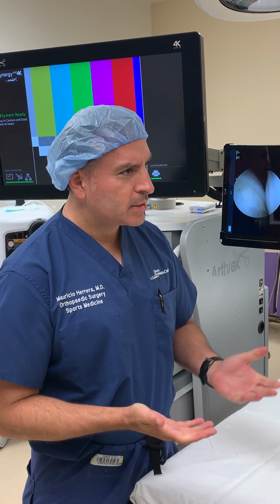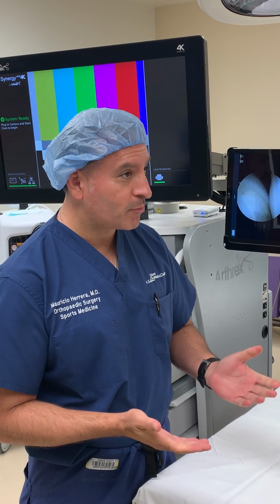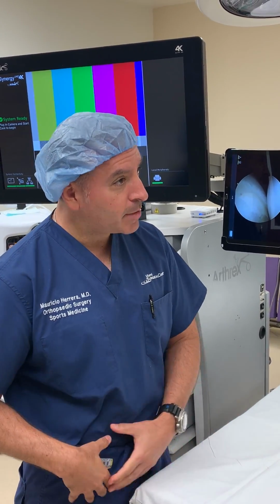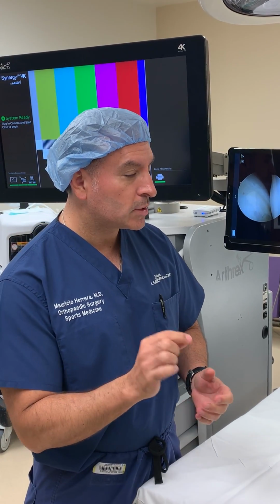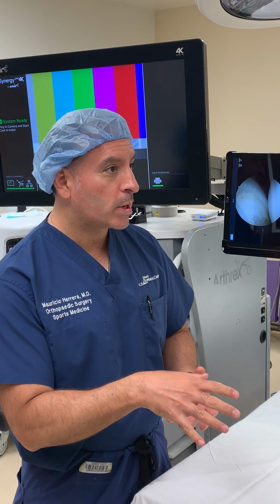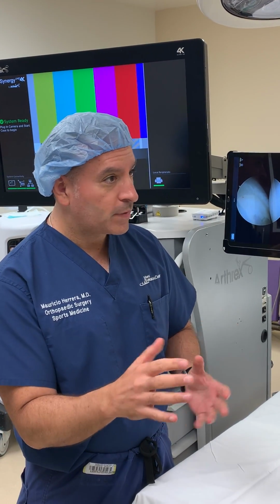So what actually is hip arthroscopy? Hip arthroscopy is a minimally invasive procedure where we place a fiber optic camera inside a patient's hip joint, generally done through 2 or 3 very small keyhole incisions. It allows us to place this fiber optic camera in the hip joint without causing any damage, and we get a bird's eye view of the entire hip joint.